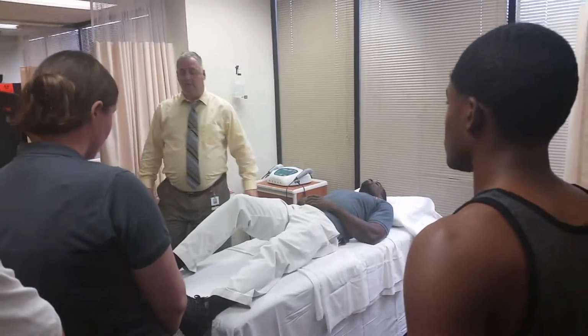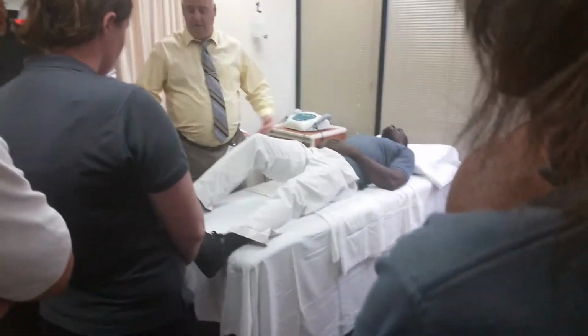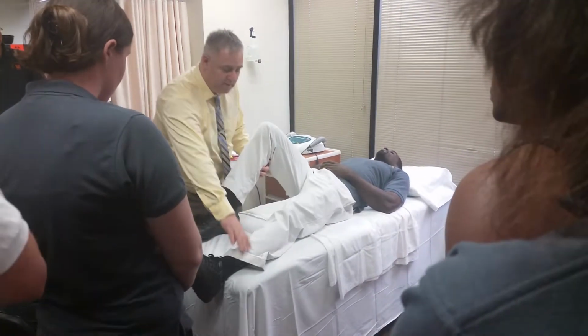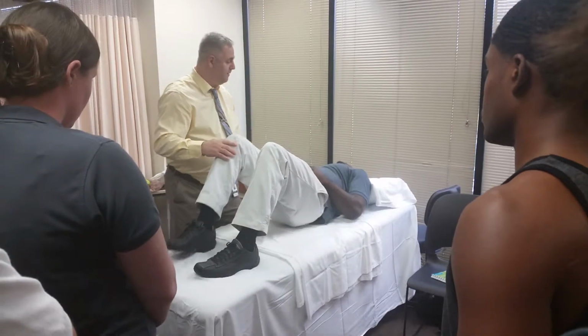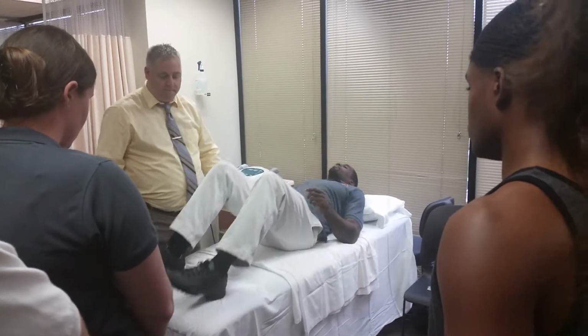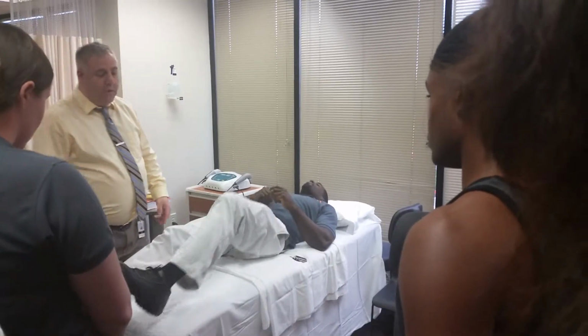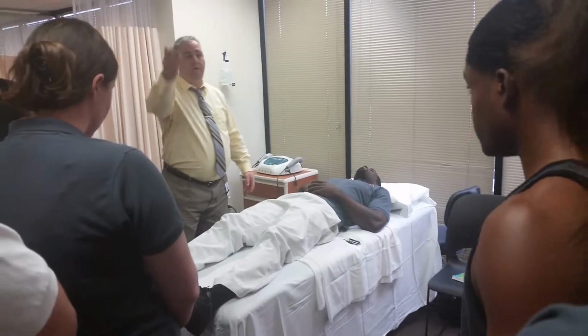All right, so there's a couple different ways to do this. If he was strong enough, he would bend his legs, lift up his pelvis, and scooch up, and up he would go. If he's too weak to do that, we could raise the bottom of the bed up.